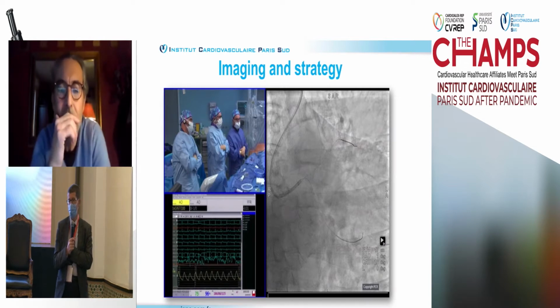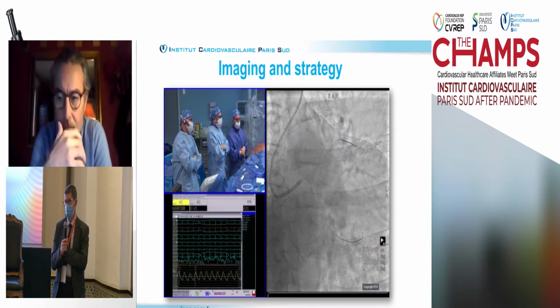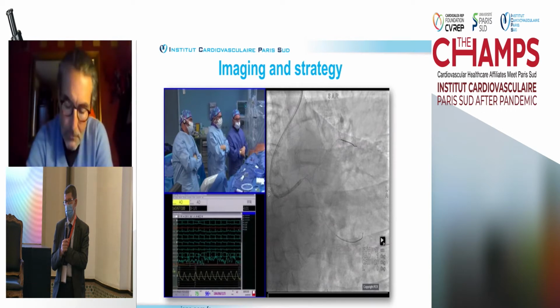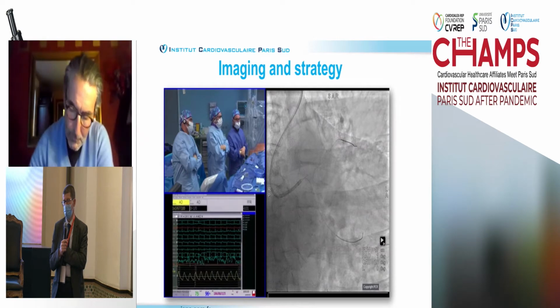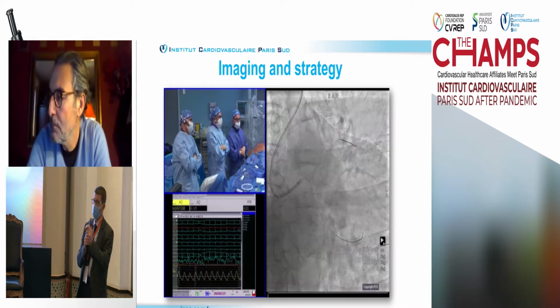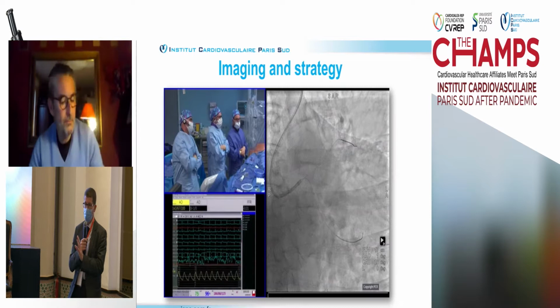I'm not sure that the plaque involves the distal left main. So I prefer to dilate and do an IVUS before taking a decision to intervene on the left main with the LAD, or starting only with the ostium of the LAD to the distal part. Okay, Dr. Subhi, without the IVUS, are you going to fix the diagonal or just do the stent from the left main to the mid LAD and ignore the diagonal?